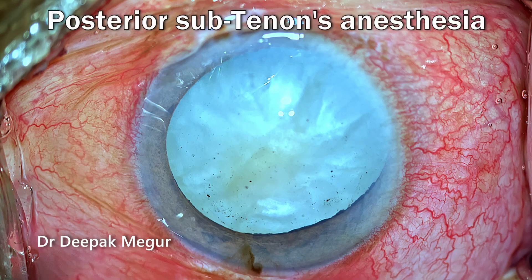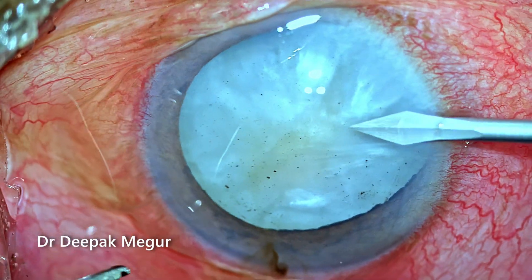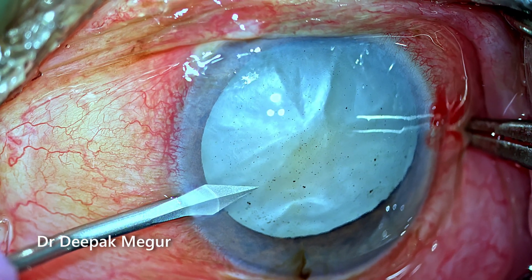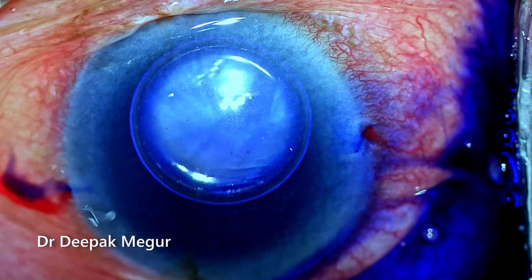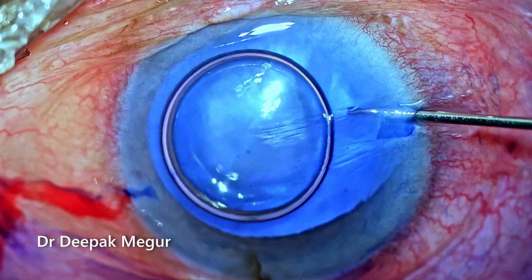Surgery is being done under posterior sub-Tenon's anesthesia and I planned a phacoemulsification to be performed in this case. The challenge here is to get the rhexis right — that's the main challenge. If the rhexis is all right, I'll continue with phacoemulsification; otherwise, I need to go back to an alternative technique.